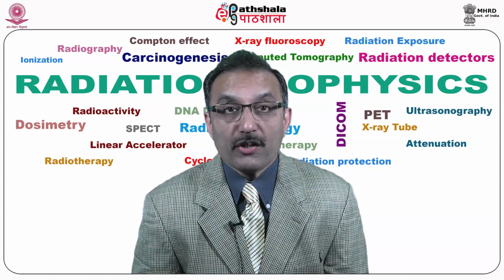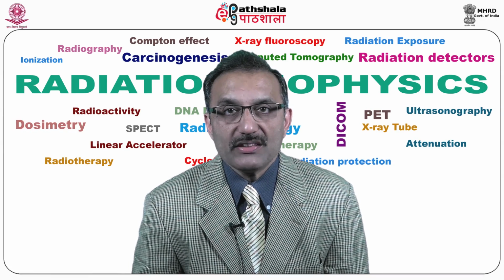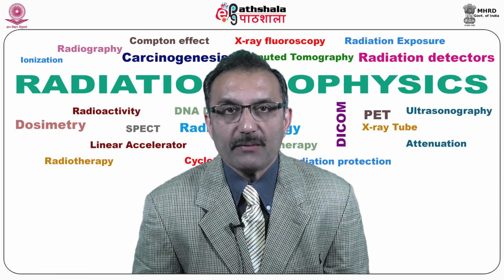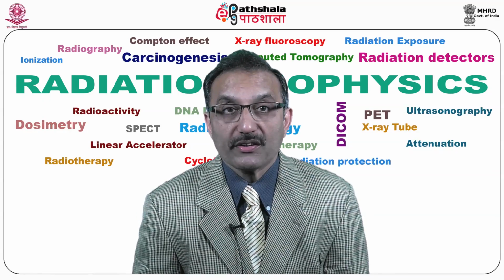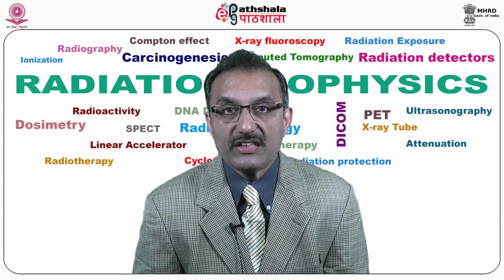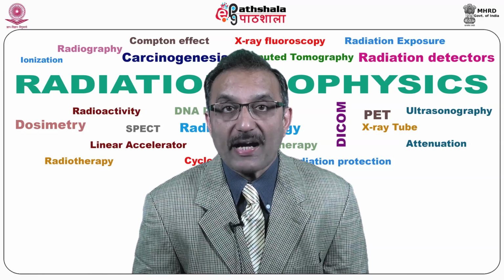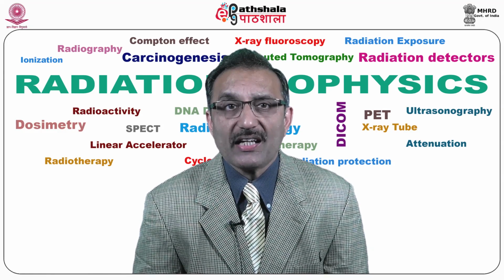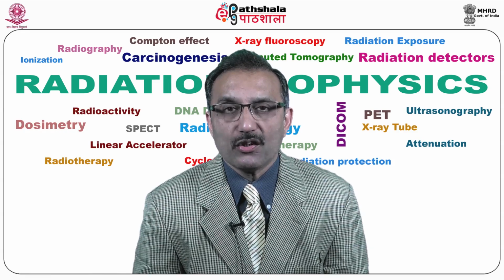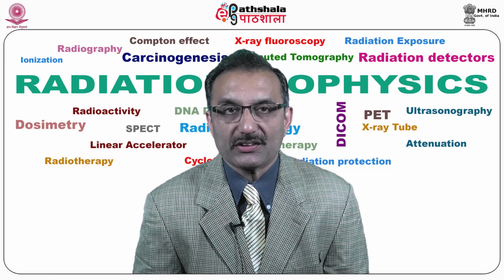Also, because the radioactive substance decays quickly and is effective for a short period of time, it must be produced in a laboratory near the PET scanner. It is important to be on time for the appointment and to receive the radioactive substance at the scheduled time. PET must be done by a nuclear medicine physician who is specialized in nuclear medicine and has substantial experience with PET. Most large medical centers now have PET services available to their patients.